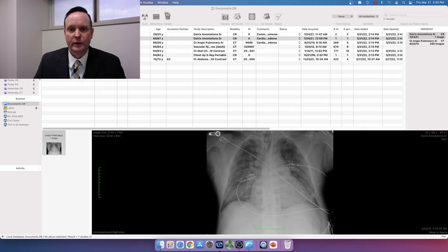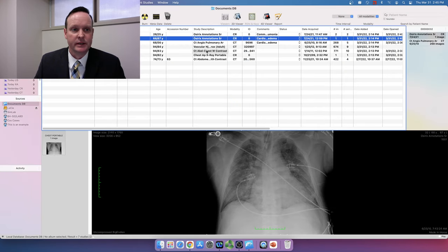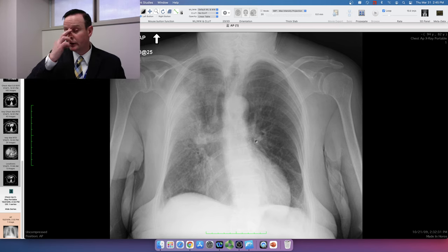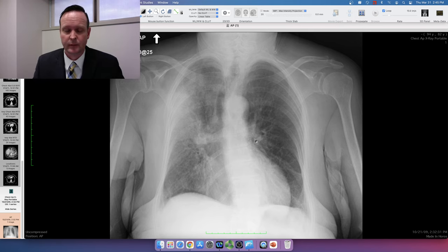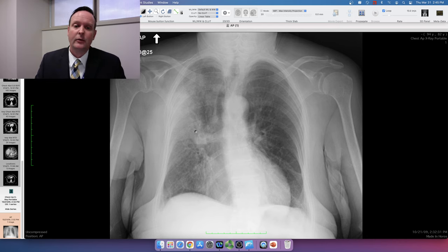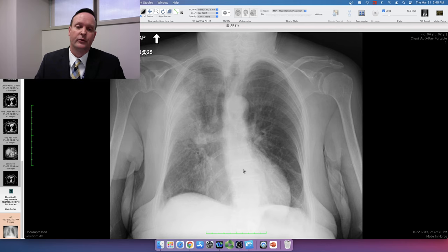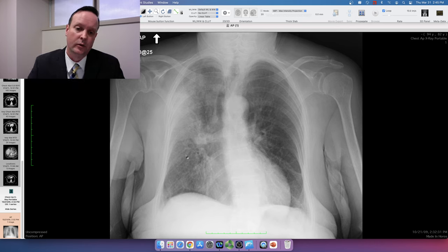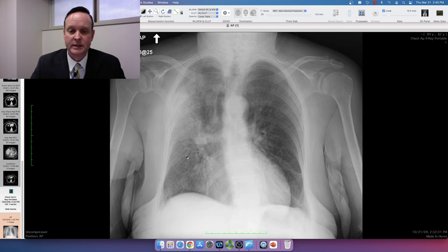The third case is an 82-year-old patient who presented with prolonged cough. Out in the periphery of the lung, we see increased opacity of the right upper lobe with air bronchograms passing through it. It appears to adhere to the horizontal and oblique fissure — a classic appearance of a consolidation.